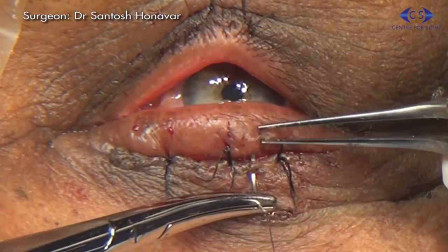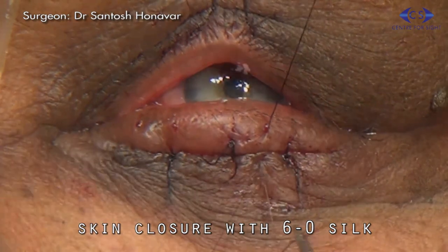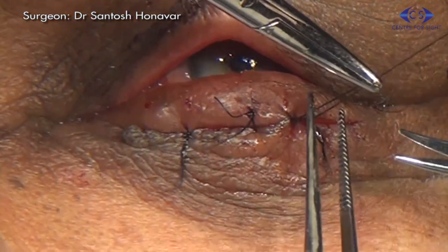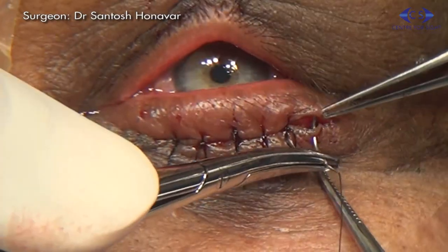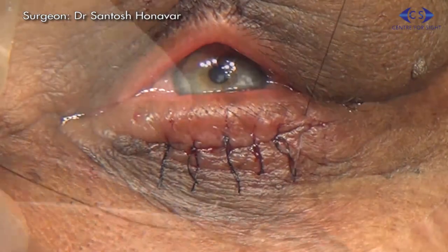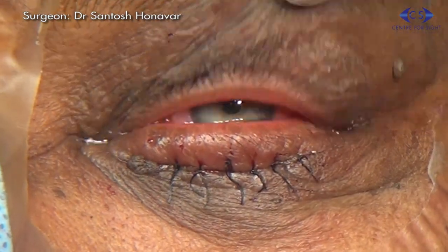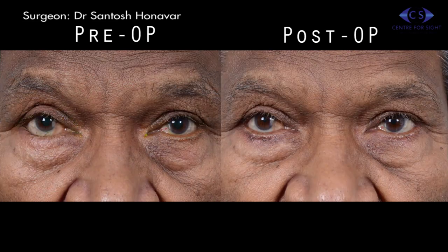The remainder of the skin is then closed with 6-0 silk. These are the pre- and post-operative comparative pictures of patients who underwent a similar procedure, with an excellent outcome.